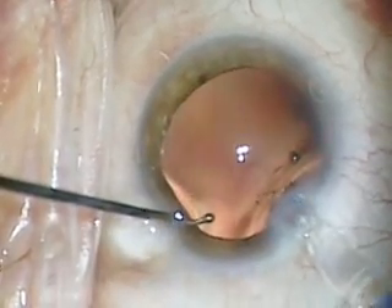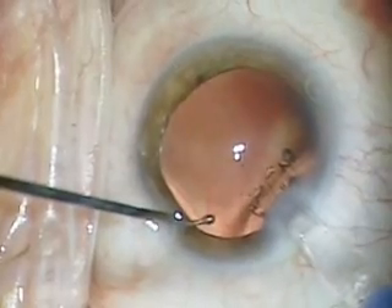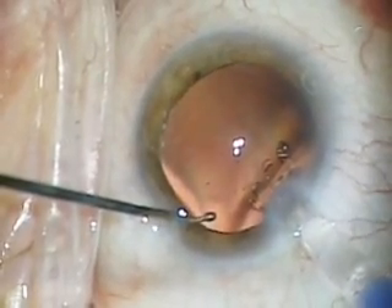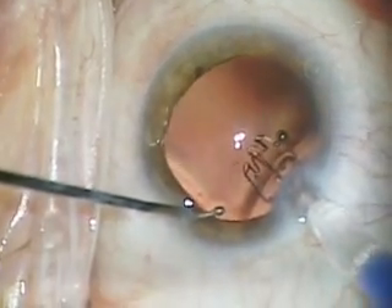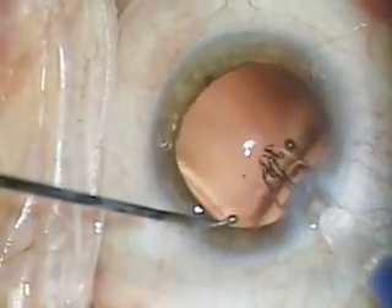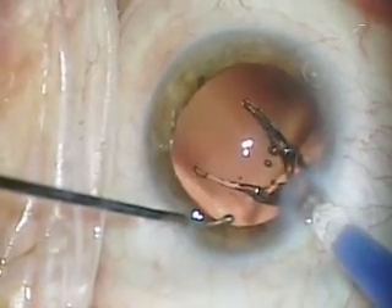The lens has four-point fixation, as you'll see in a moment. As it injects, you'll notice that it appears to have claws that point upwards towards the cornea — this is how you know you have the lens in the correct position. And you just slowly push the lens out.